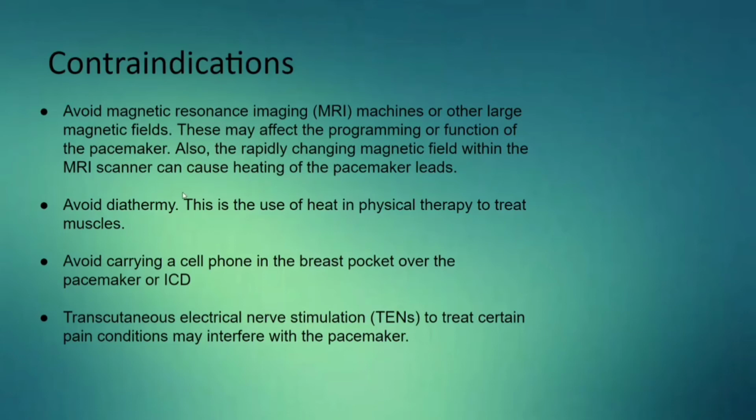And they should avoid diathermy, which is the use of heat in physical therapy or to treat muscles, and they should avoid carrying a cell phone in the breast pocket over the pacemaker or ICD, and they should be careful about transcutaneous electrical nerve stimulation, which treats certain pain conditions, and it may interfere with the pacemaker.